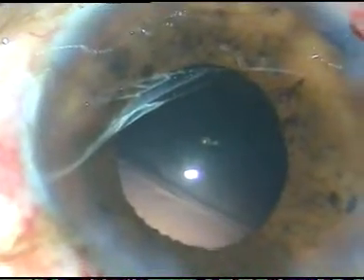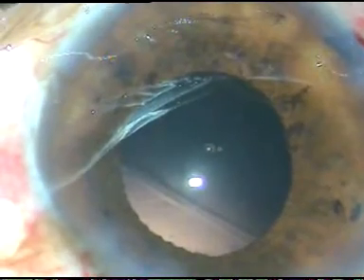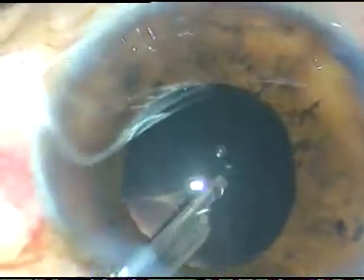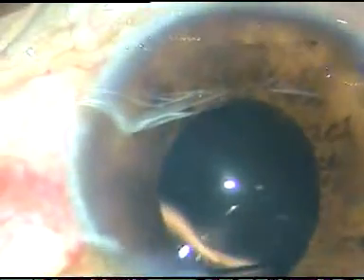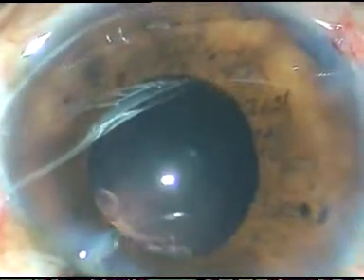This patient had astigmatism at 30 degrees, so I have enlarged the side port on the left side. And the cortex has been removed.